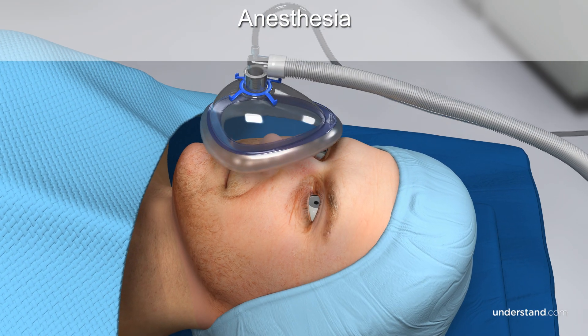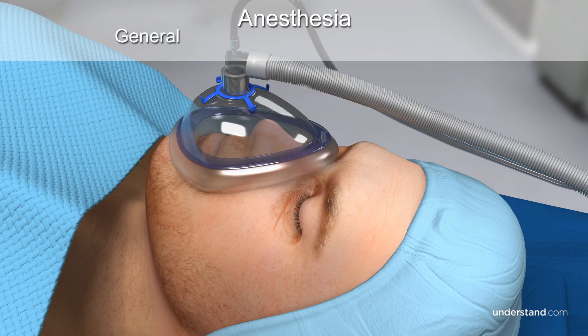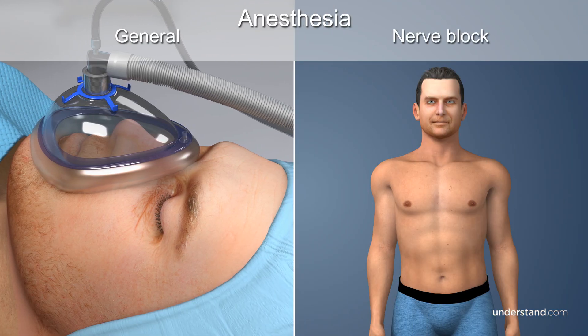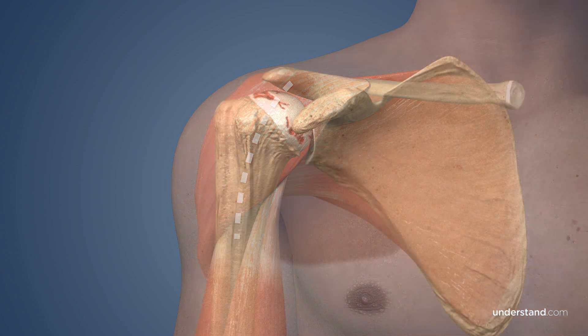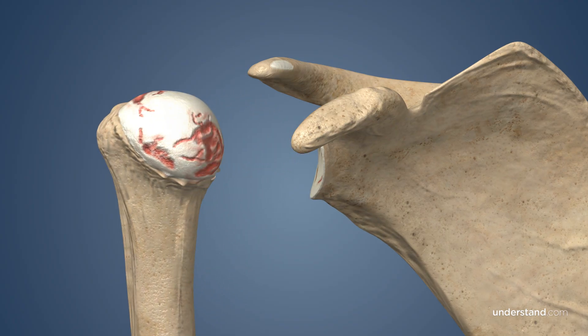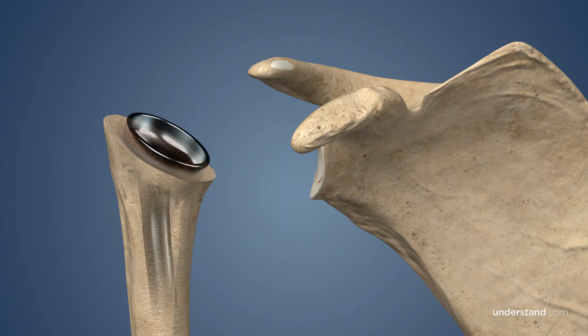Depending upon your preference and that of the anesthesiologist, you will be put under general anesthesia and/or a nerve block. Your surgeon will make a single incision through the skin to access the shoulder joint. Your arm is rotated and the head of the humerus is removed. Next, a space is created in the humerus, and your surgeon will insert the stem portion of the prosthesis into the bone. The plastic cup is then fitted onto the humeral side.